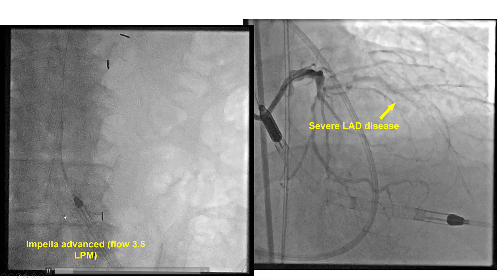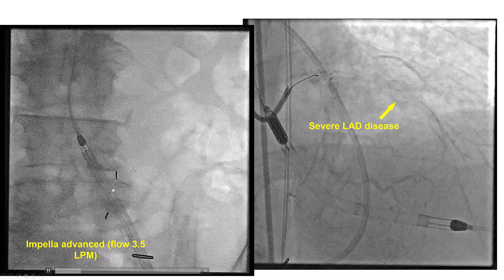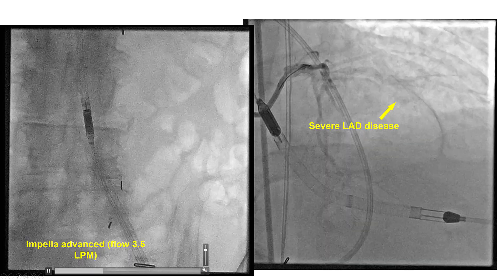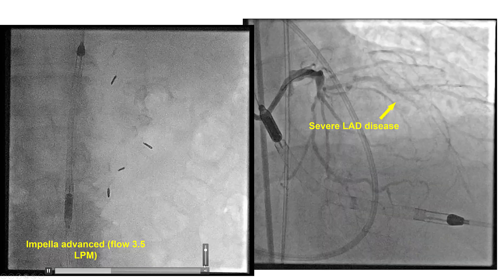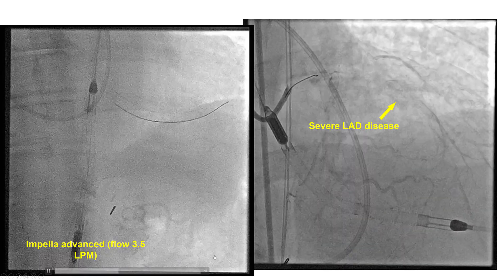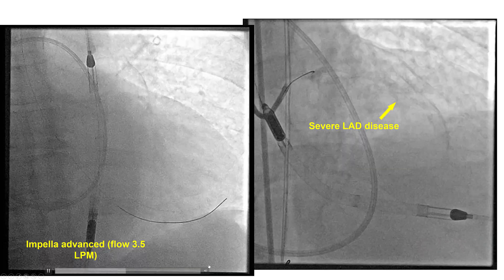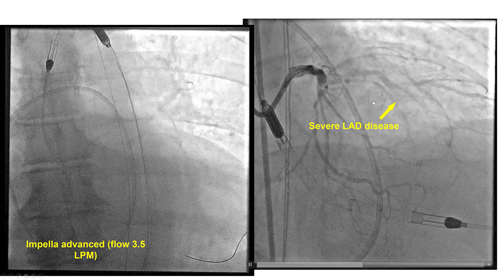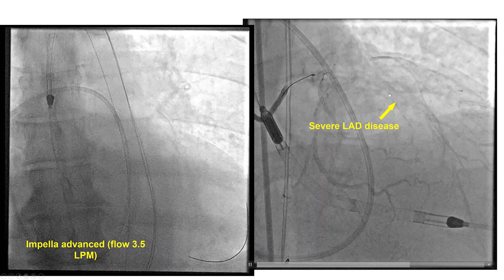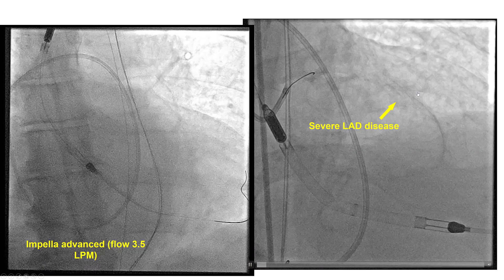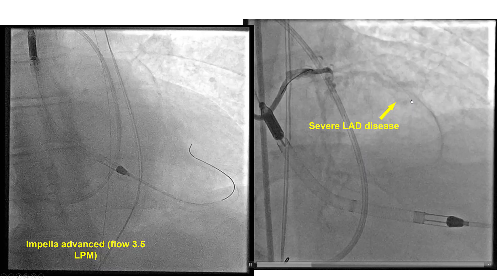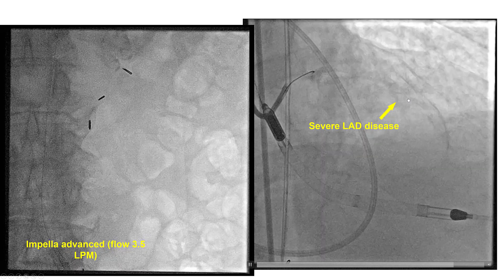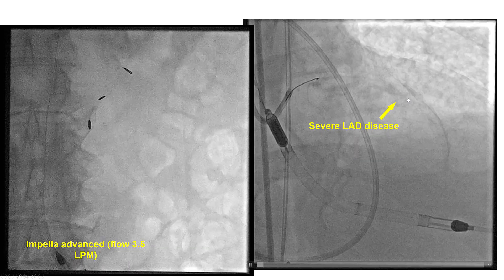The Impella was successfully inserted into the left ventricle, and support was initiated, providing flows of 3.5 liters per minute. Diagnostic angiography shows the same finding of significant disease in the proximal and middle LAD with the CTO of the middle LAD.